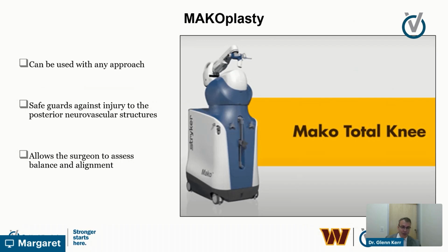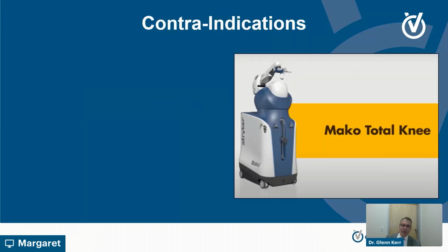And I want to go out to the waiting area and talk to the husband or wife and tell them this knee is perfectly balanced. And also the alignment of the knee, that I can look visually at the screen and really tell exactly what that functional and mechanical alignment of the knee is following that. Longer term outcomes, we're at a point with robotics. This was new technology years ago, but we're approaching about 12 or 13 years, particularly with the partial knee replacements, that just show a marked improvement in both the alignment of the implants as well as the long-term survivability of the implants.